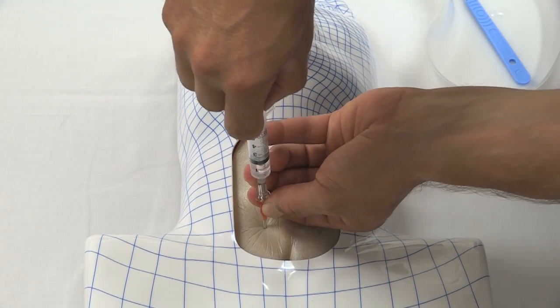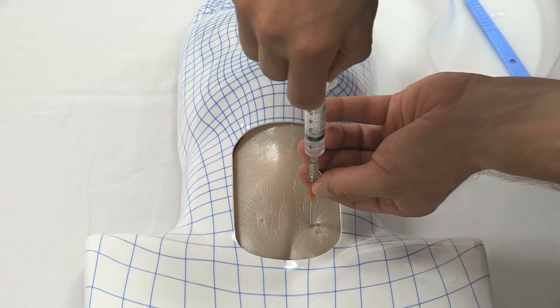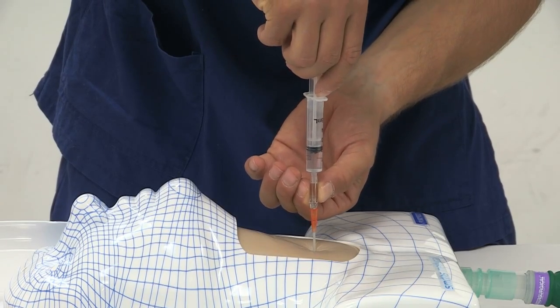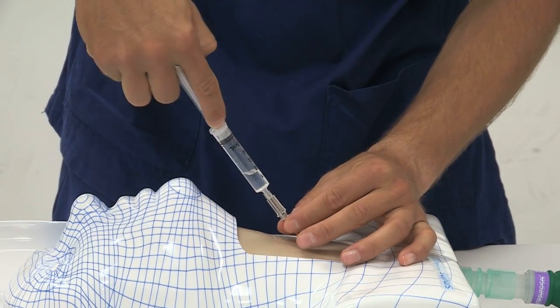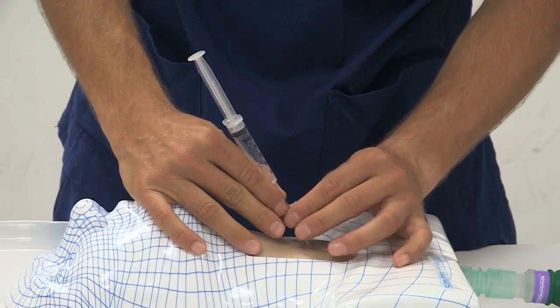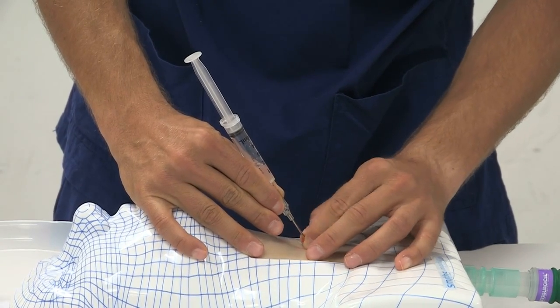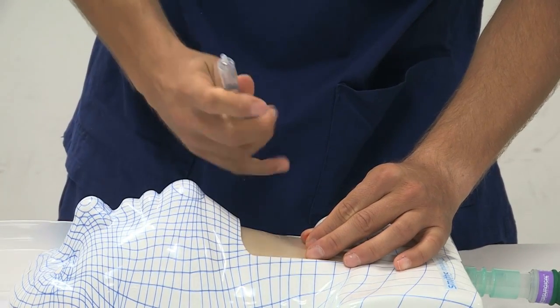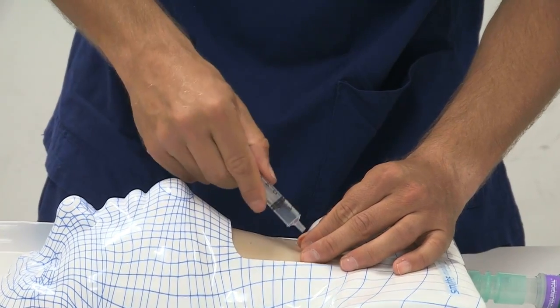After the initial midline approach, the second and third attempt should be on either side of the midline. Once air aspiration has been achieved, the angle of the trocar may be decreased if required and the trocar stabilized by the dominant hand. The non-dominant hand then advances the cannula into the airway. Once the cannula has been inserted, a check aspiration has to be performed to confirm correct placement of the cannula.